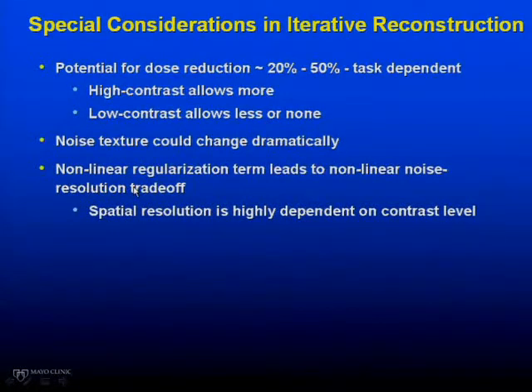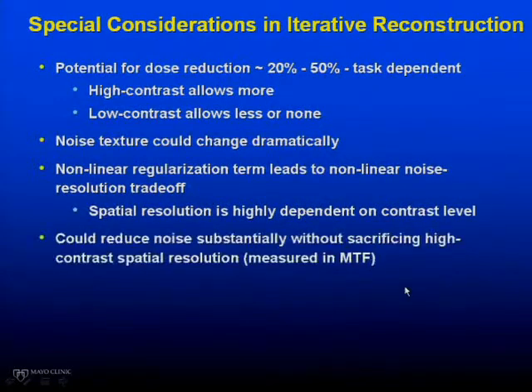As mentioned yesterday in Dr. Fessler's talk, the nonlinear regularization term also leads to a nonlinear noise resolution trade-off. So spatial resolution is highly dependent on the contrast level. If you do an evaluation, you may observe that the noise can be reduced a lot, but the high contrast spatial resolution, if you measure the MTF, almost doesn't change at all.